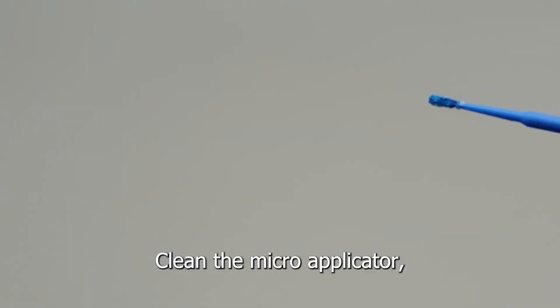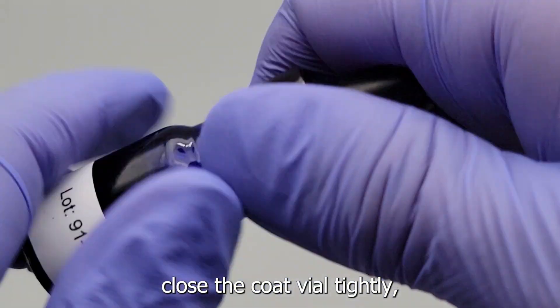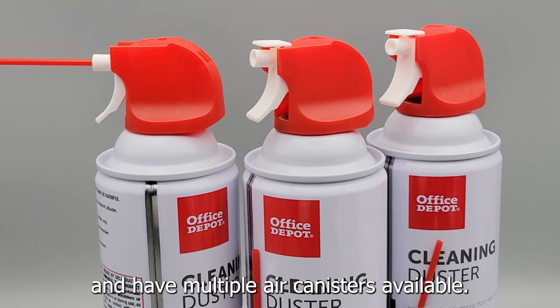A few final tips: clean the micro applicator, close the coat vial tightly, and have multiple air canisters available.